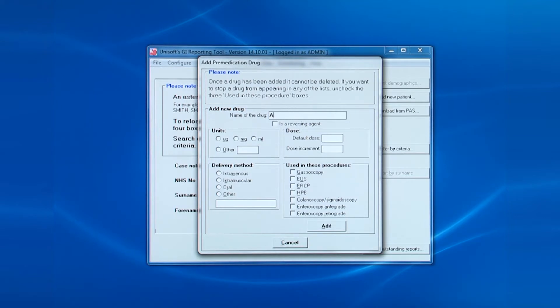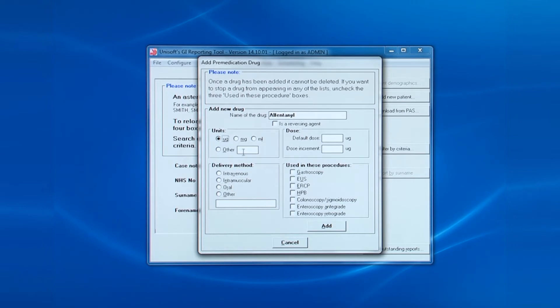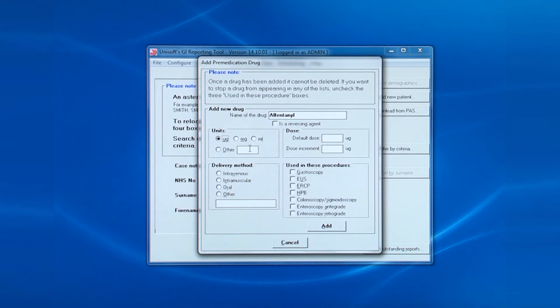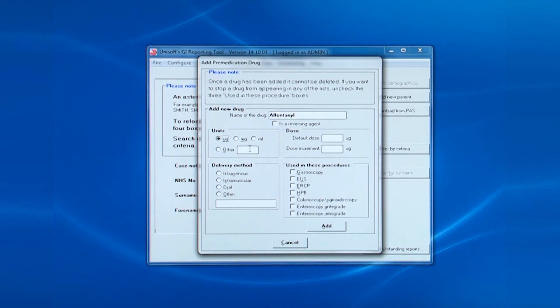We add the name. We don't click the box for reversing agent. We select the units, micrograms in this case.